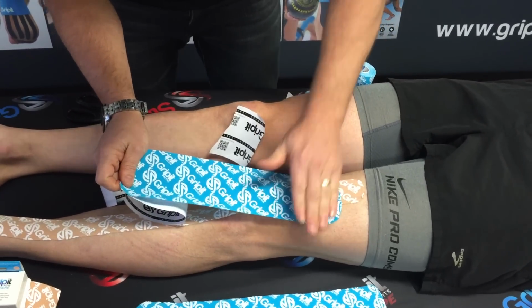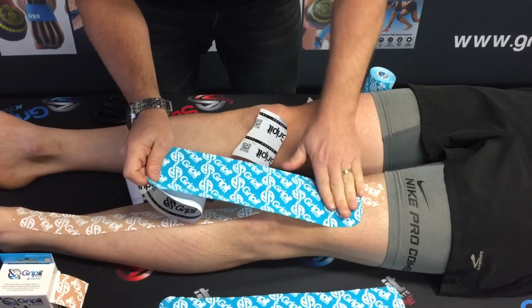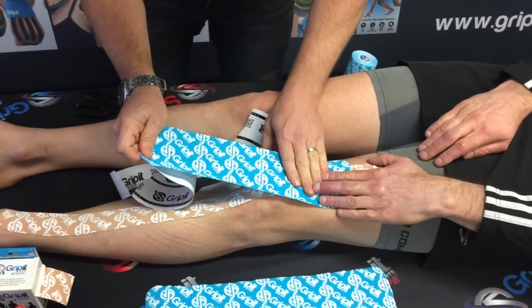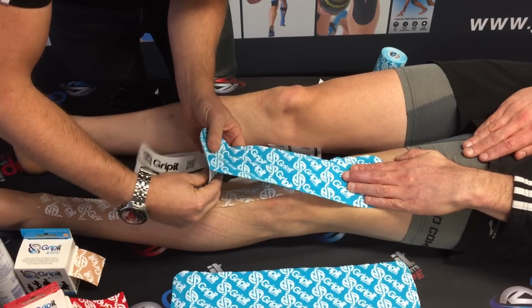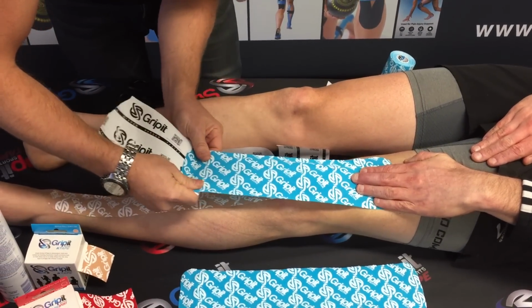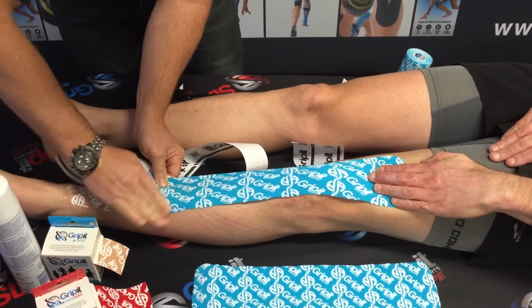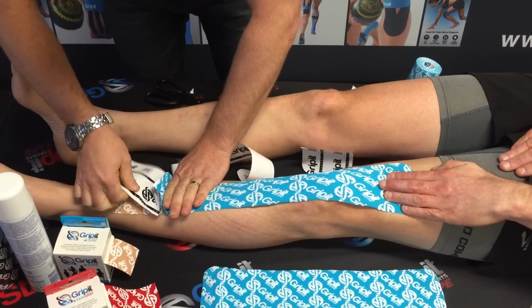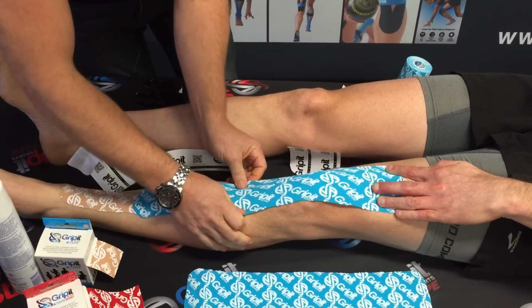So generally if I want to crank it up and I've just got myself and the patient or the player or the athlete, Danny, if you could just put your hand there so they can hold that anchor, and as they hold the anchor, you can really crank that up and get the stretch effect that you're after. Okay, so here you can see I'm cranking that up there. I generally lay it down around the bottom here and then quickly lock off my end, and then you can just work the tape a bit if you want to.